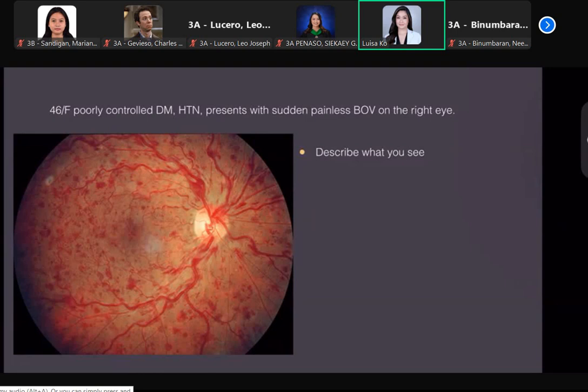I'd say intraretinal. Actually, all of these are intraretinal hemorrhages. It depends on the layer of the retina where the bleeding occurs. Remember the characteristics of each layer of the retina. I'm talking about the flame-shaped hemorrhages, by the way, which we missed. So dot and blot, yes. Flame-shaped also.